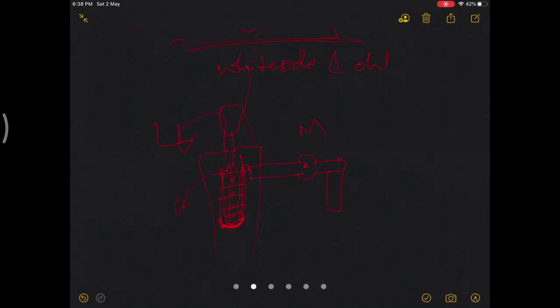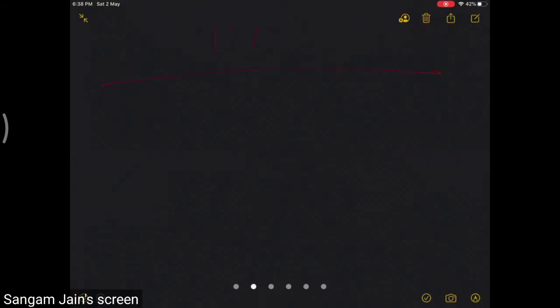Okay, and there is a maneuver. It's not an exposure technique. It is called Insall's technique, the Ranawat and Insall technique. That is to externally rotate the foot so that the patella is easily subluxated on the lateral side. This you might have observed.